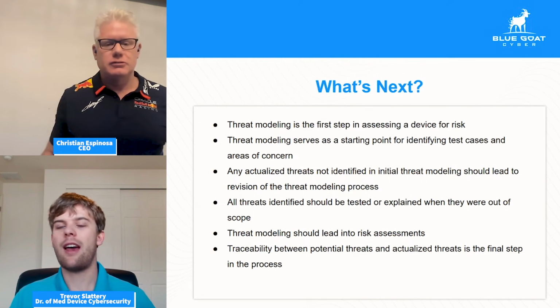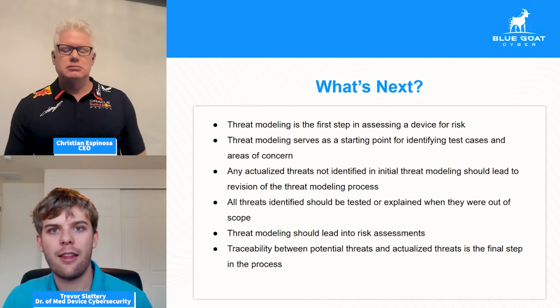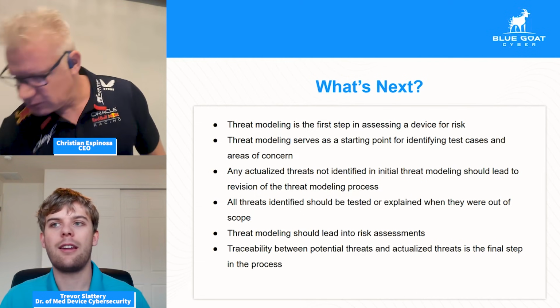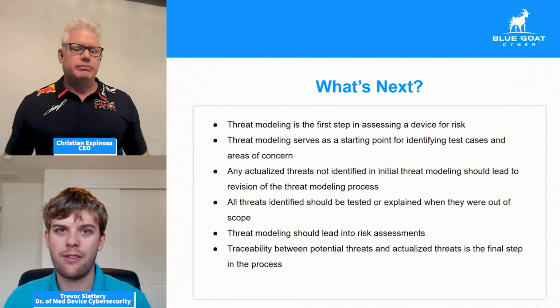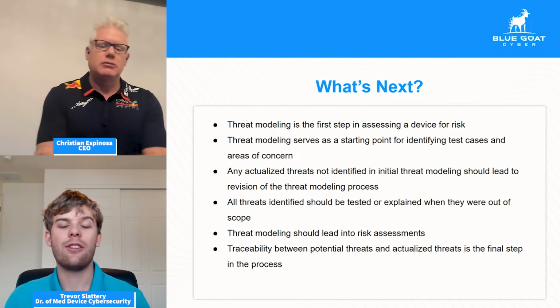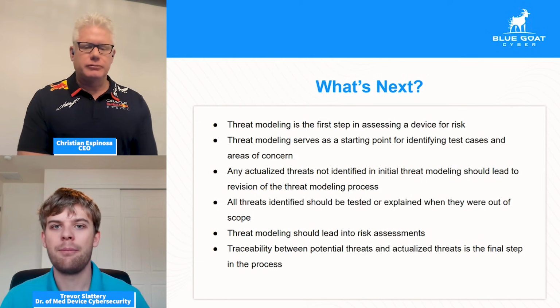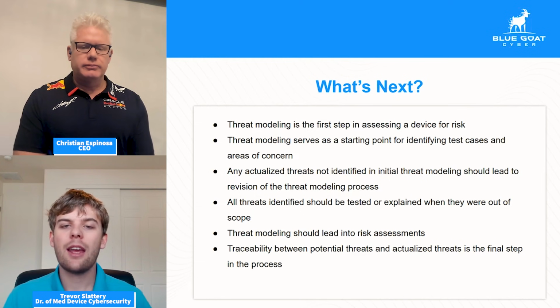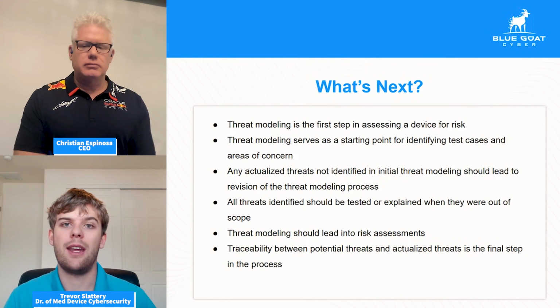If we go through, we test all of these input fields for different injection attacks where we aren't able to identify anything. We get in, we try to access the database, and we realize that it's a randomly generated 32-character password. We're never going to guess that. We're never going to brute force that. So that is a threat that we cannot actually realize. Mitigations are already in place. There's data sanitization on any input fields. There is a very strong password policy for the database. So mitigations are already in place. If we identify it's not the case, then we need to start building those mitigations in.